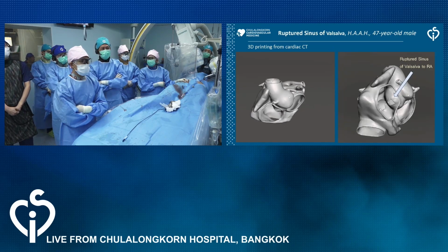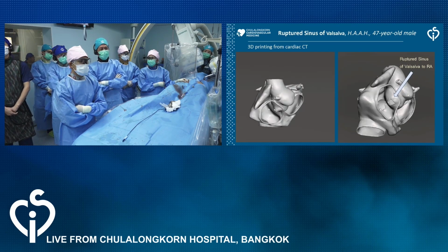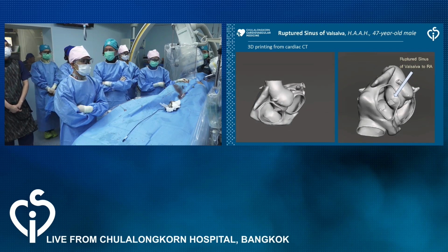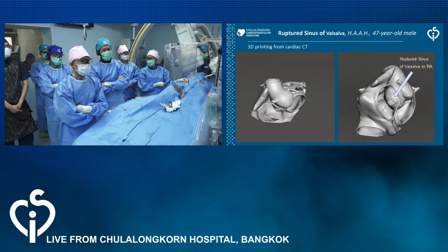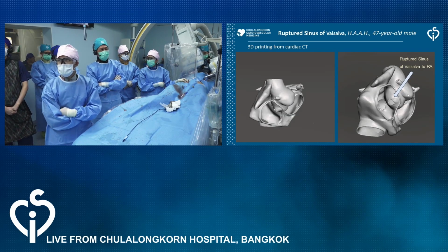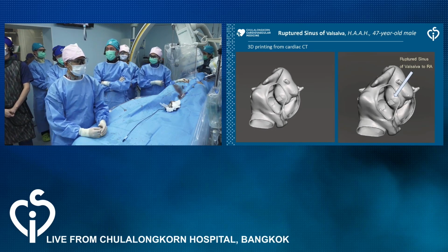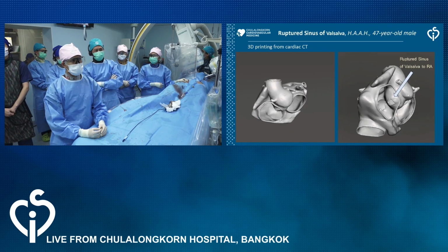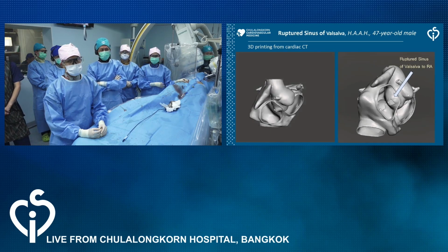Yes, a biopsy would be interesting. We don't have a biopsy at this time. But we think that we have to close it to reduce the LV volume load. So now if you keep going through the slides and show us the rupture.